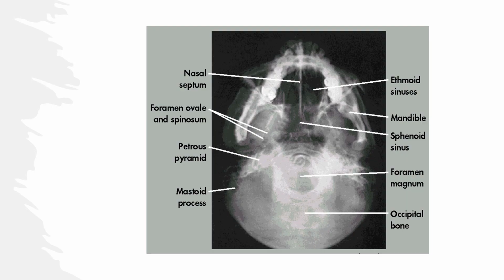All right, I've done it again. So here is your image critique for your SMV. Now this was done with a phantom. There is a neck attached, but good luck getting your patient to be as flexible as this phantom is.